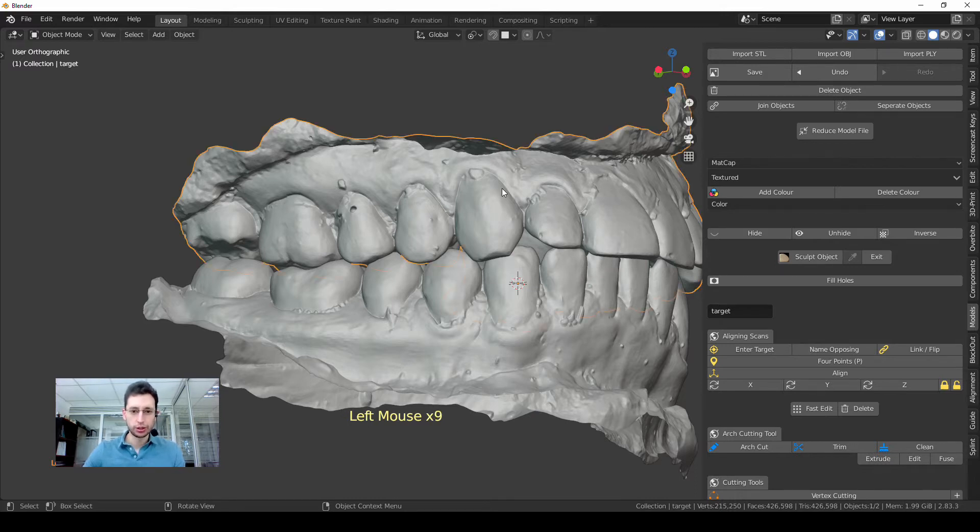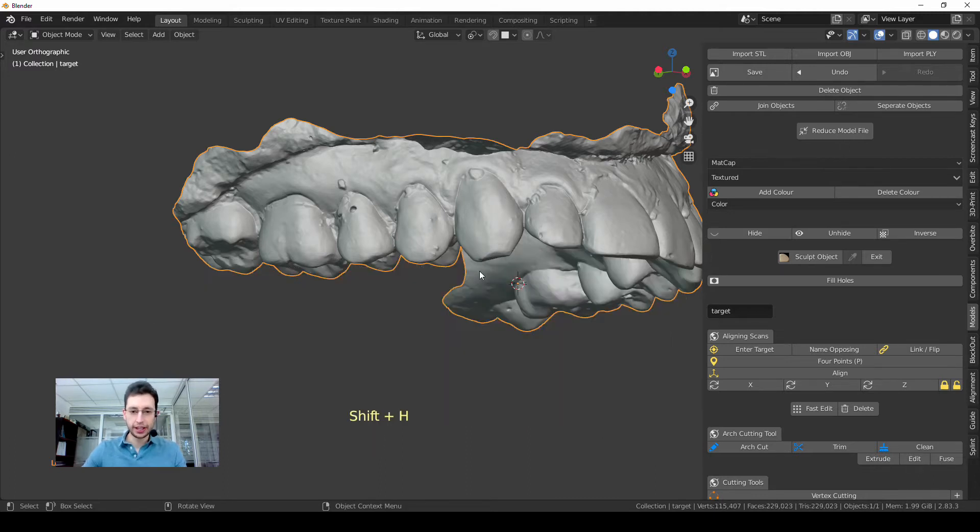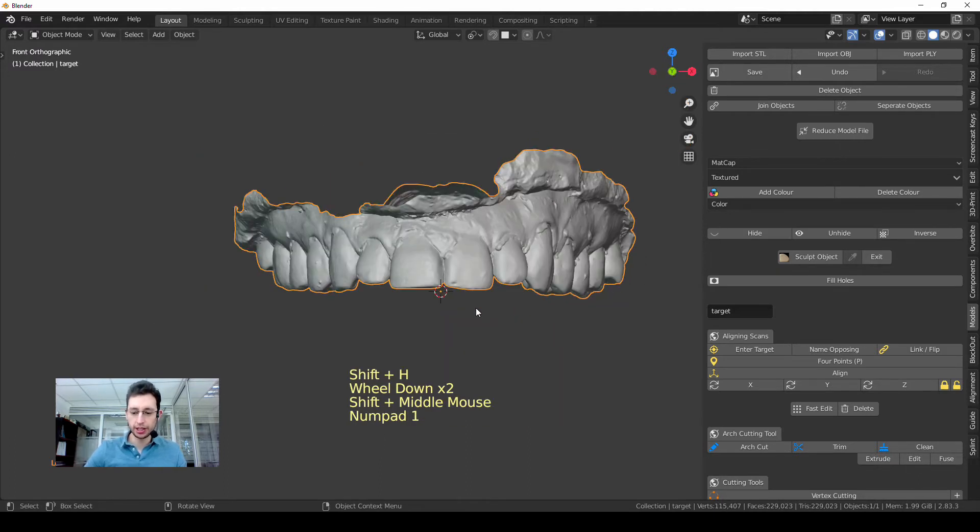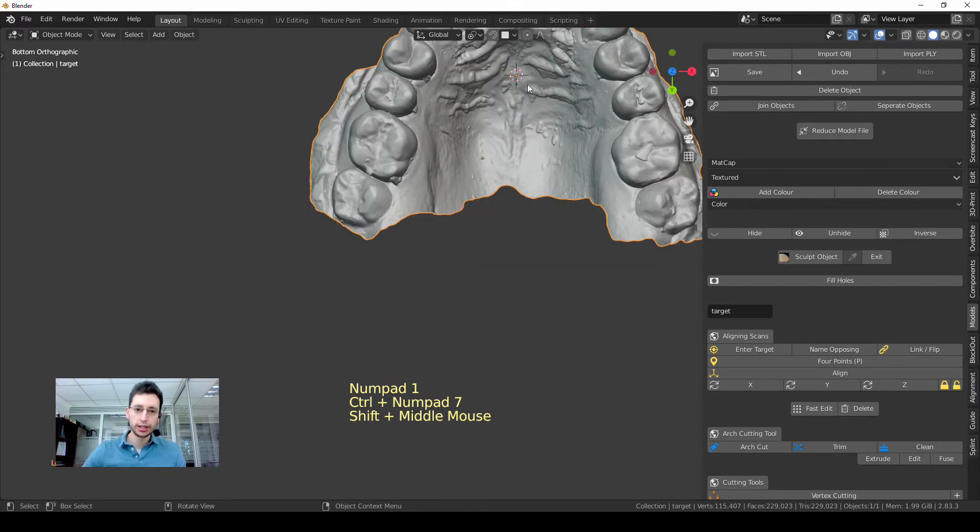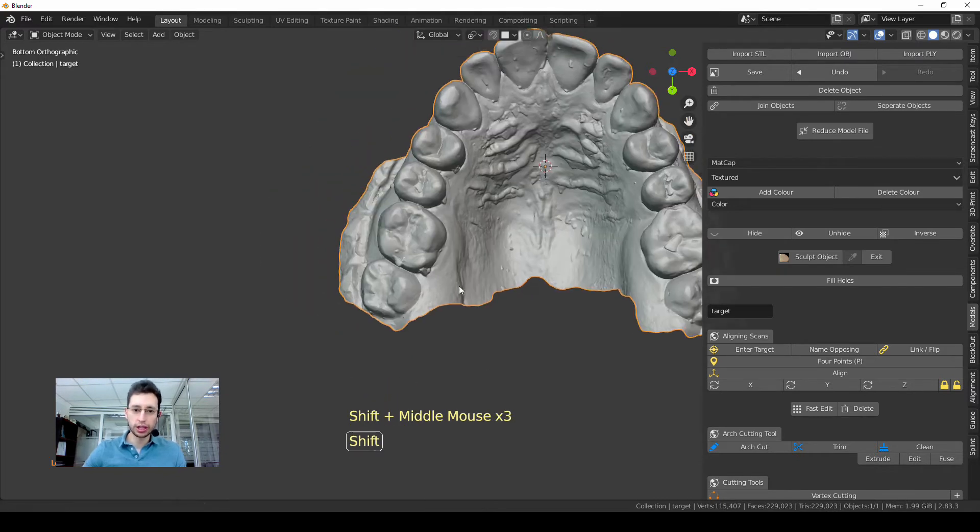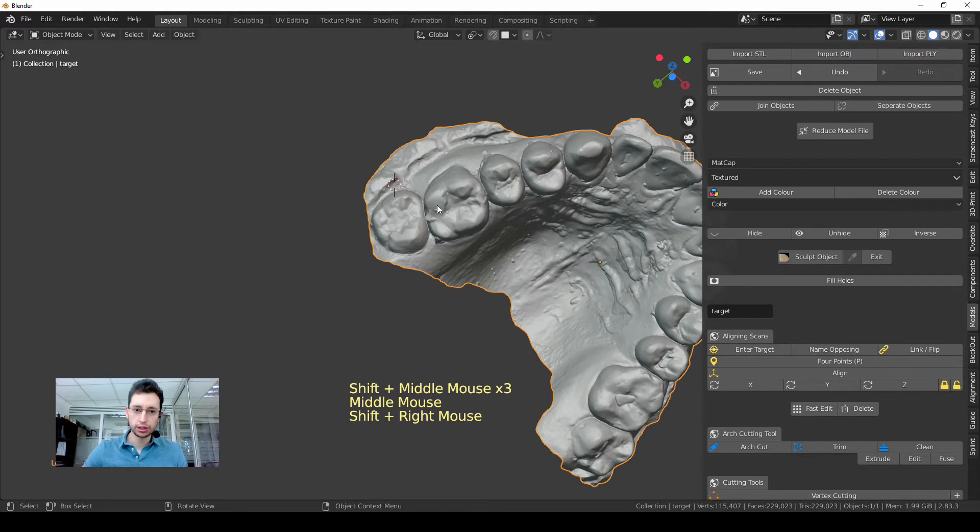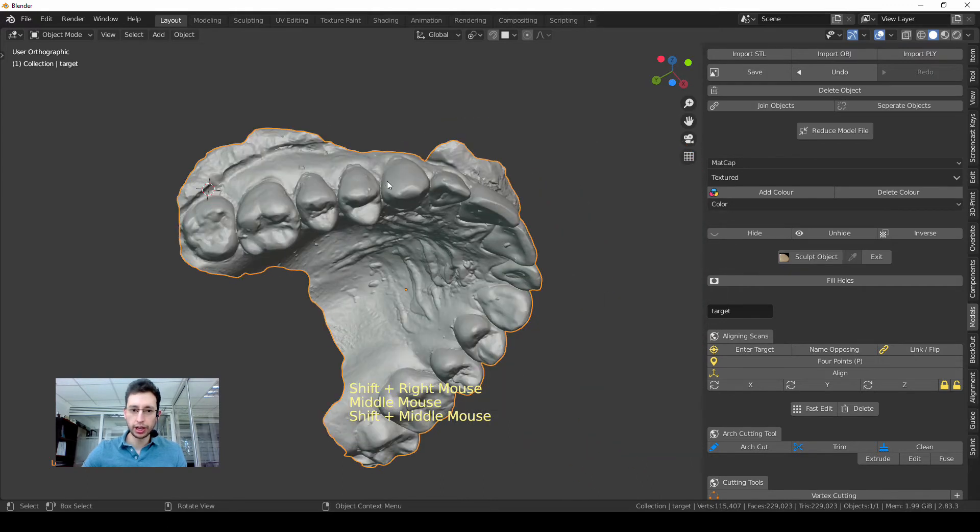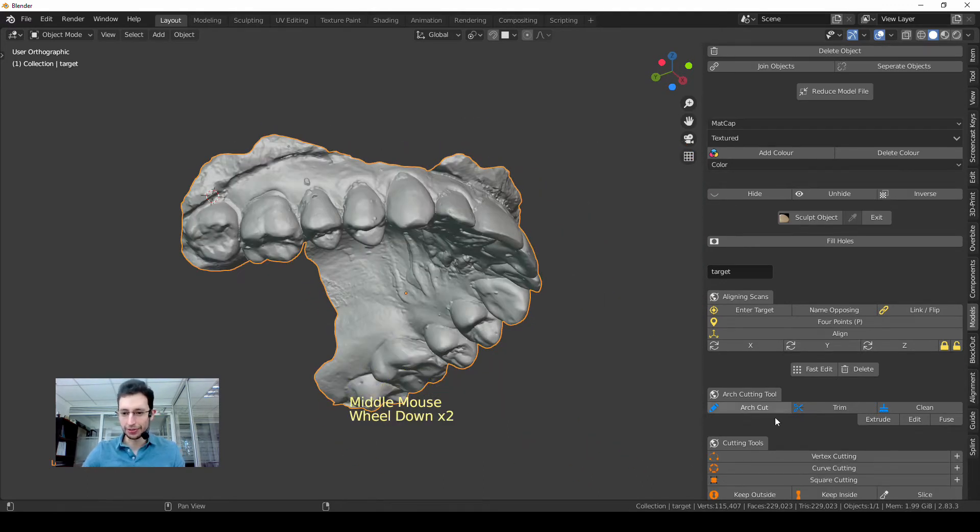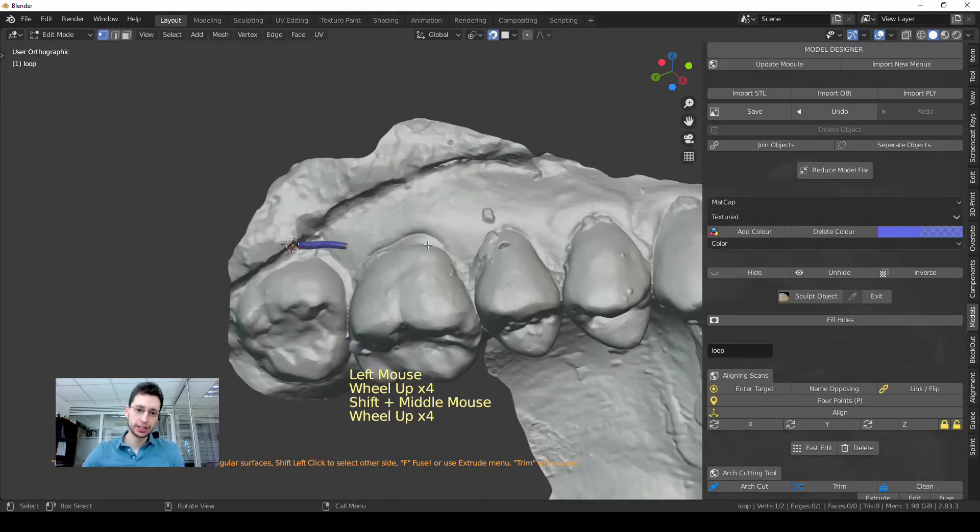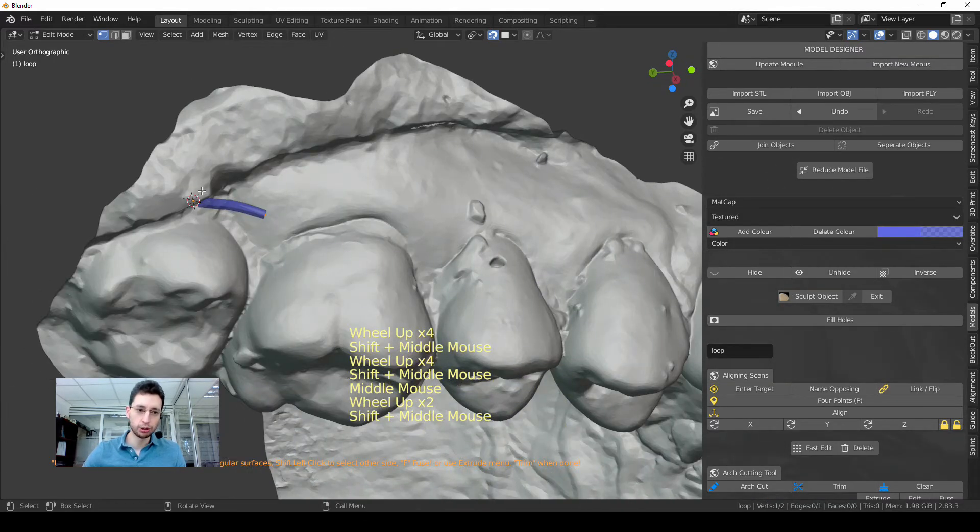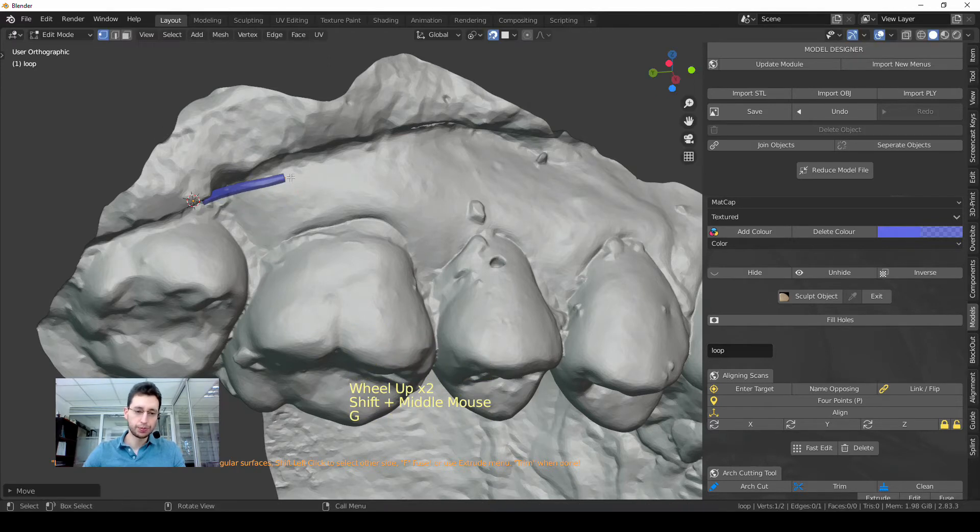I will press Shift and H to hide everything but the model I want to work with, and then I will use the cursor to start removing all that wrong stuff. So I use the arch cut and that generates this small line, this small tube.